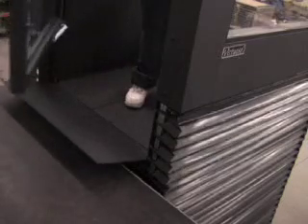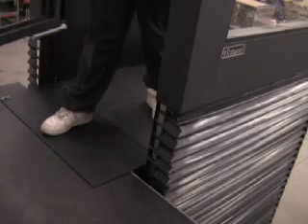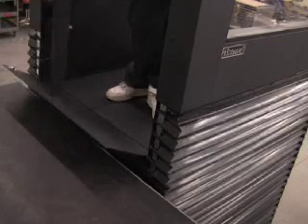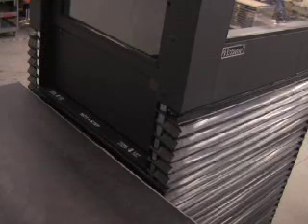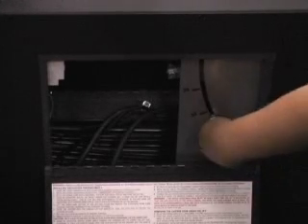Open the upper landing gate completely and verify that the dock plate is approximately level and rests securely on the upper landing so that the user can make a smooth, level, and safe transition to and from the lift car. Adjust the height of the lift car as necessary until the dock plate position is correct. With the lift car at the correct height, loosen the height adjustment knob and move it along the adjustment scale until a detent or click is felt.